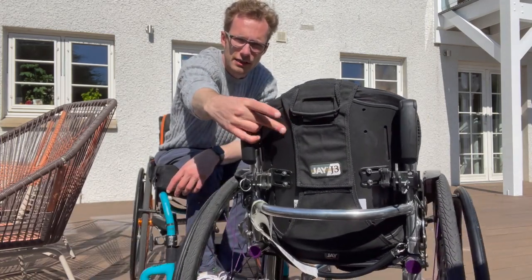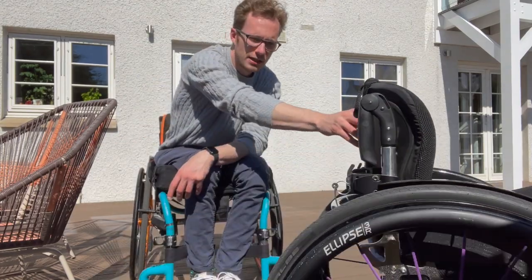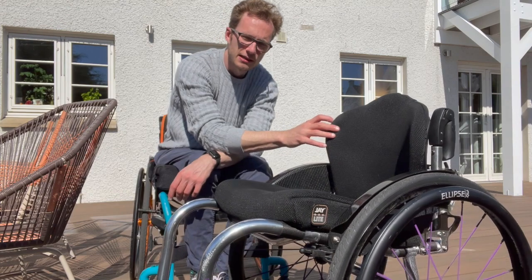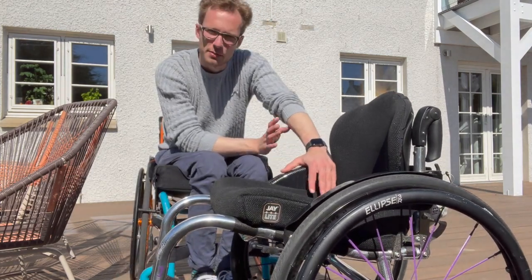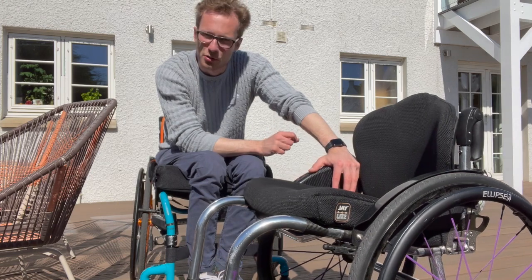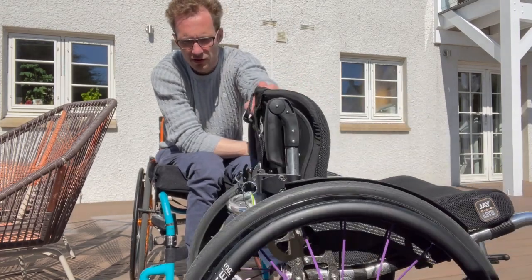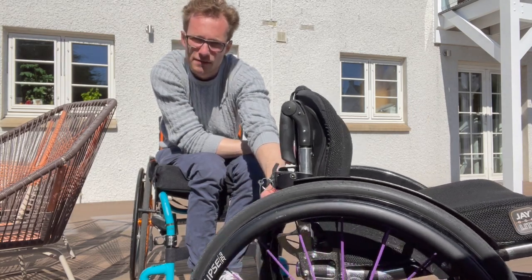The backrest is actually not something I ordered with the chair — it's a J3 and I swapped it from my Helium to this chair, because this chair came with a standard fabric backrest which was a little bit low and soft for me. I prefer a hard backrest because, having a relatively high thoracic injury and no core control on account of being complete, I find having stability — especially when leaning back — really important. The back side of the chair has a curved bar which is really solid and good for lifting.